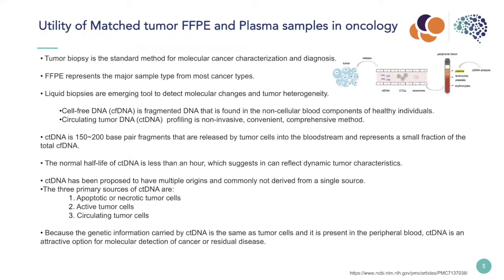So to orient everyone to some of the core biology that we'll be discussing, this is a little bit of a wordy slide, but knowing that everybody's reading it on their screen, I wanted to touch on a couple of high points. I'm sure we all appreciate that tumor biopsy has really become a standard method for molecular cancer characterization and diagnosis.